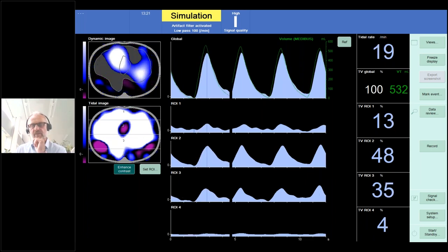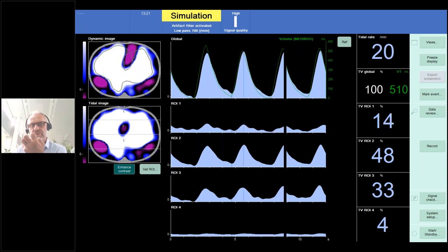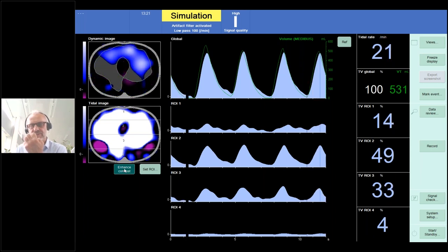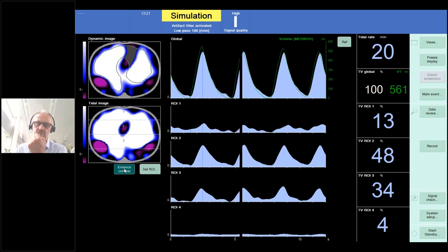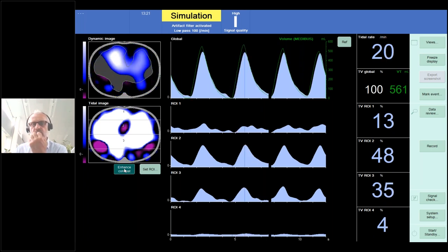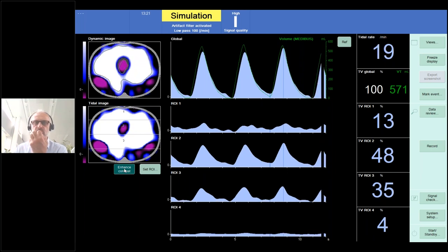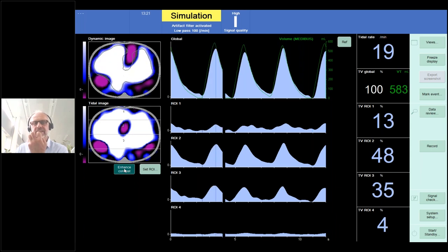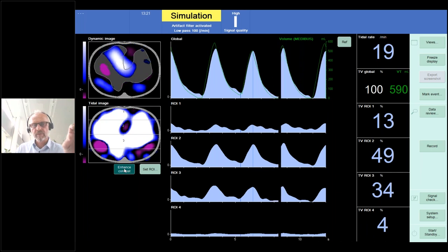But basically, what we utilize in this view is the interpretation of some reconstruction artifacts that are caused by physiological conditions. Right now, we are not making any claims. We also do not do a quantification of those purple regions. That is something for the future. But at least we can clearly demonstrate the effect of fluid on the lung.